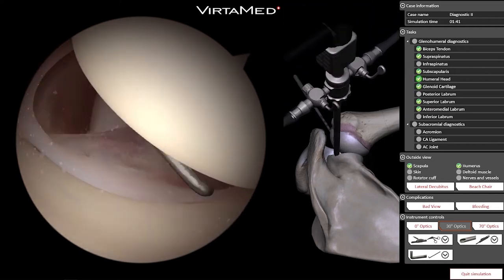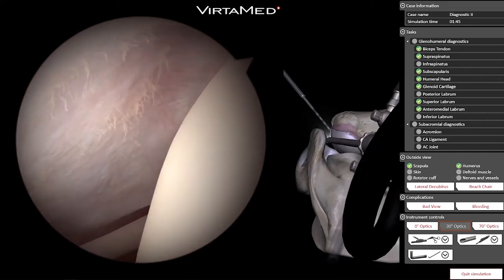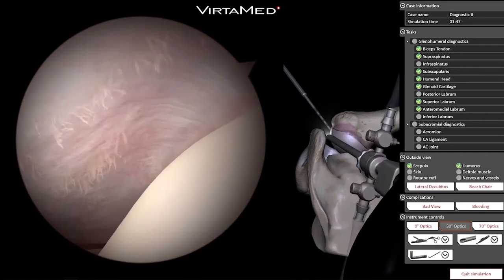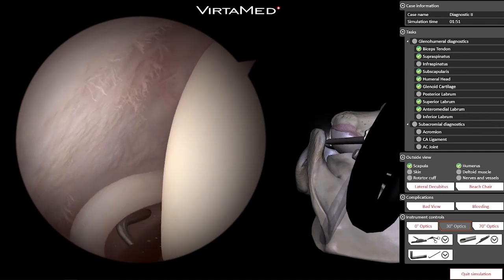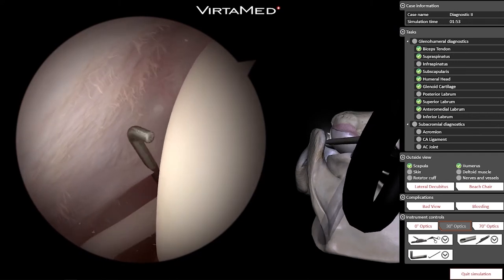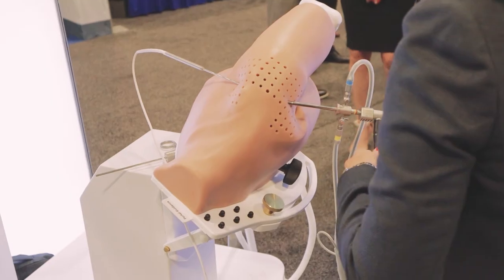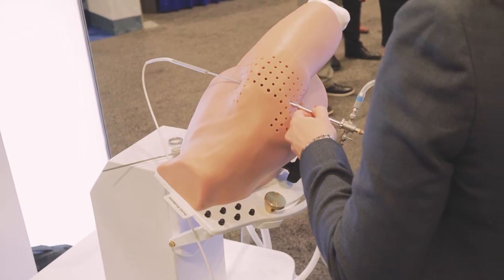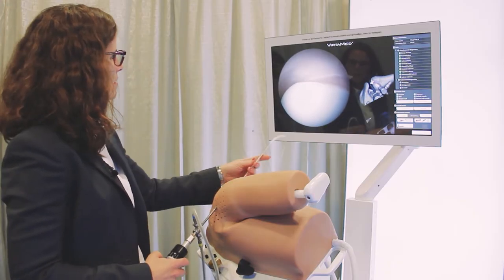There's just some fraying on the undersurface of the rotator cuff. I'm looking up at the supraspinatus tendon — it's above us right here, and the probe is touching the supraspinatus tendon. Then I'm going to shift my view a little to look at where the rotator cuff attaches to the humeral head.